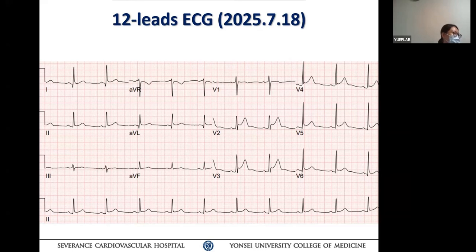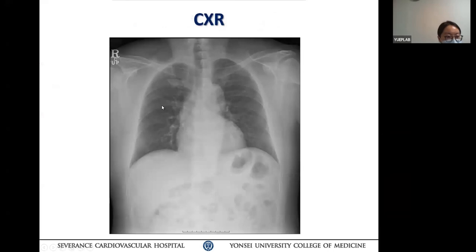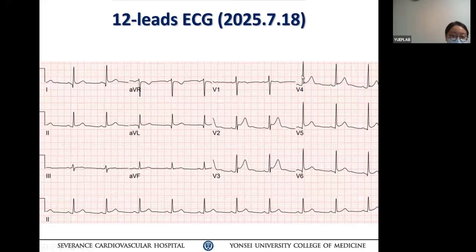Okay. But if you look at the patient's chest X-ray, look at the X-ray. What do you think about this ECG? This patient has a deep left ventricle dipping down to the diaphragm. So it's a dominantly left ventricular X-ray. And the aorta is also a little tortuous, even though the heart size is normal. So that's why the voltage in the precordial ECG leads is tall in this patient. Looks like almost LVH. That's because the right ventricle is not big in this patient. The left side is dominant. So the EKG can sometimes mislead.